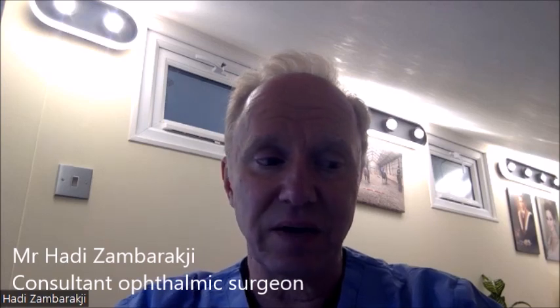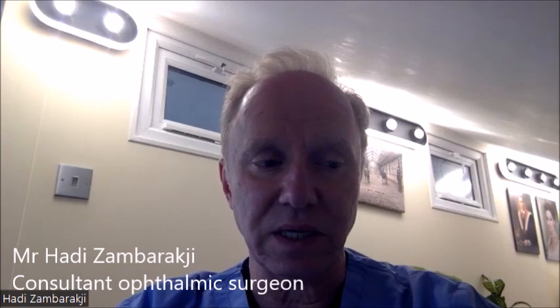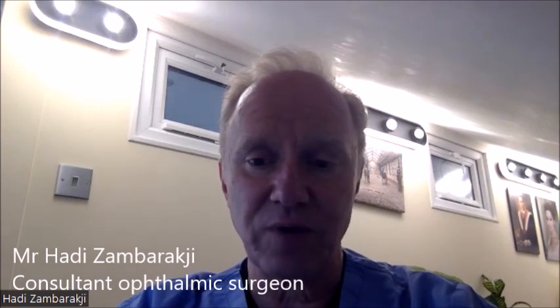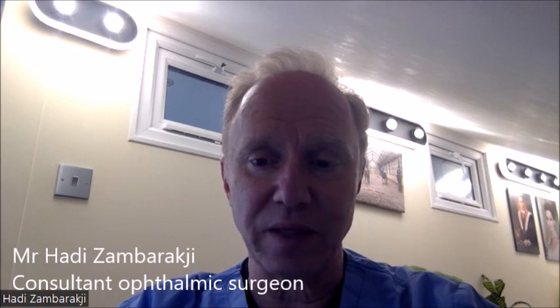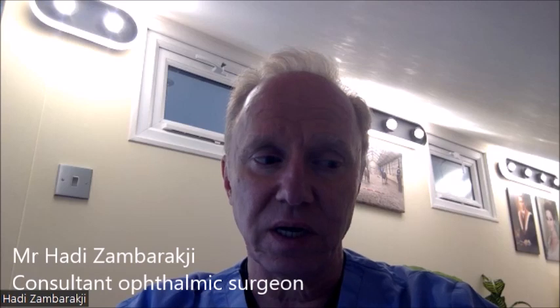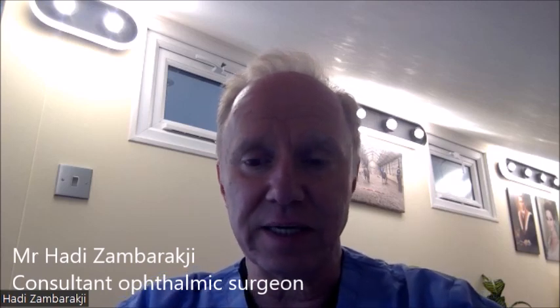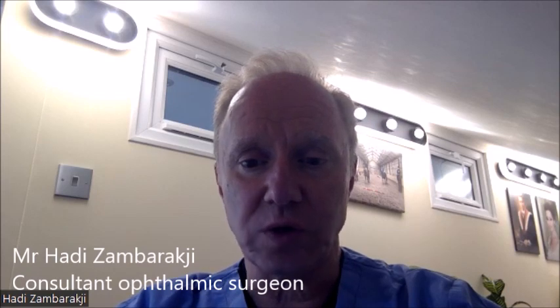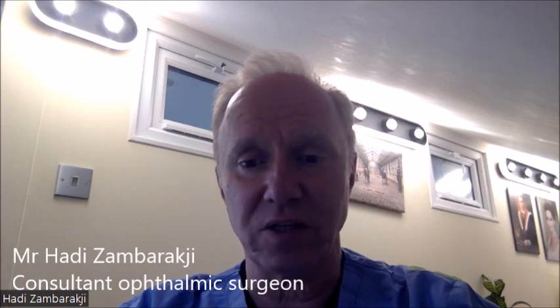Now, having said that, if I had to choose a lens for achieving spectacle independence, which is often what's being discussed in the clinic with patients, I have a fairly low threshold for using enhanced monofocal lenses with some degree of monovision correction, because they're very forgiving lenses and they're very easy to put in.